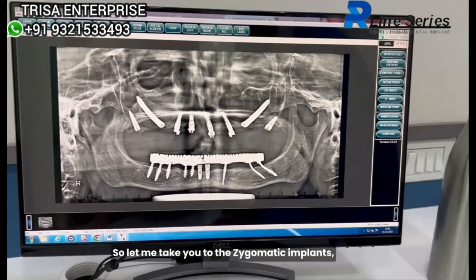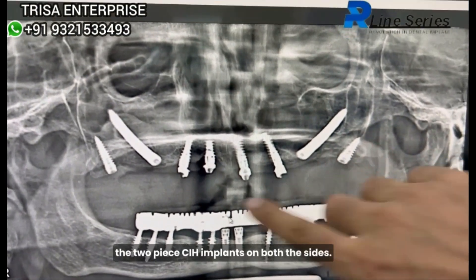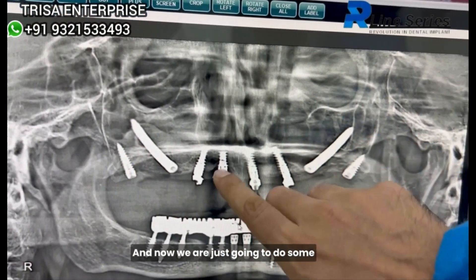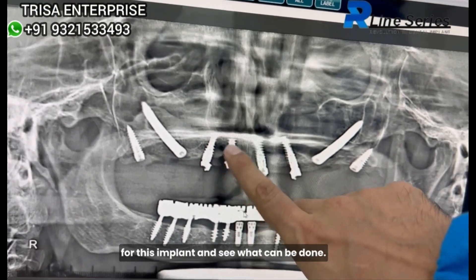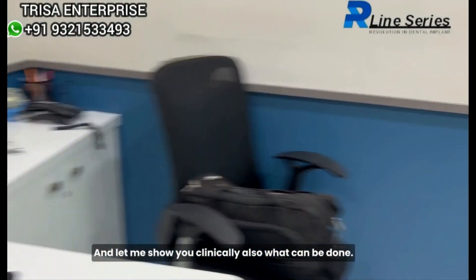These are the zygomatic implants — the two-piece CIH implants on both sides. Now we are just going to do some laser treatment if required for this tooth, and see what can be done for this implant. Let me show you clinically what can be done.